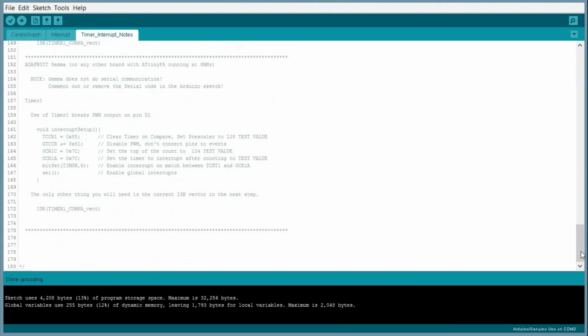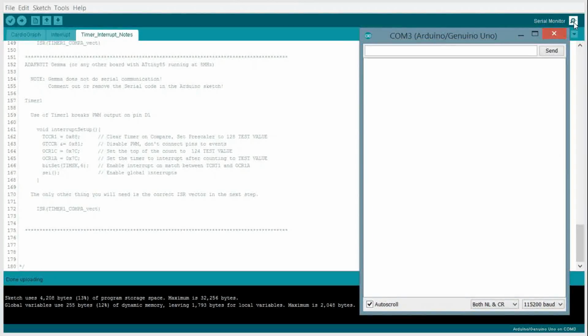All right. Now I'm going to show you what's going on in the serial monitor, just to show you what this Arduino sketch is doing. It's basically just sending data to the serial port, which will later be picked up by the processing application that does all the heartbeat analysis. I'm going to give you a little show here. I'm not actually touching the thing right now. I'm going to pick it up. Just picked it up. And now it should start getting some beat information. Hopefully if I'm holding on to this thing correctly.